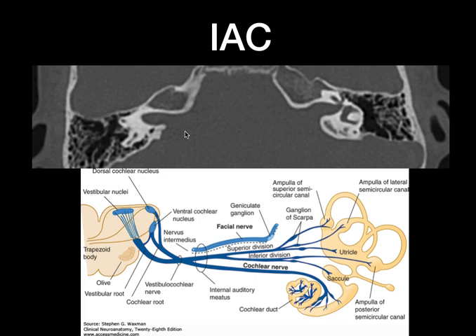Coming to the internal auditory canal — always look at the size and compare bilaterally and symmetrically. In cases of acoustic schwannomas, there will be widening of the bony internal auditory canal. The seventh and eighth cranial nerves pass through the internal auditory canal, and schwannomas are the most common cause of internal auditory canal enlargement.